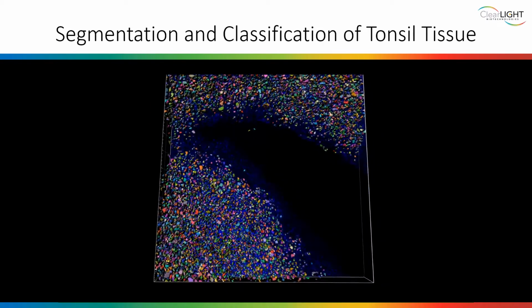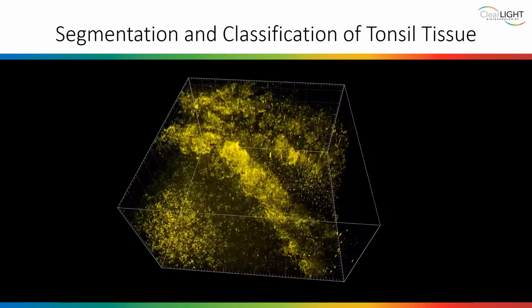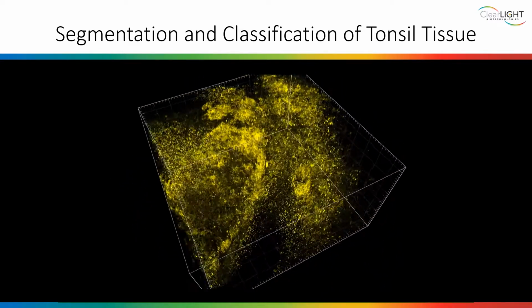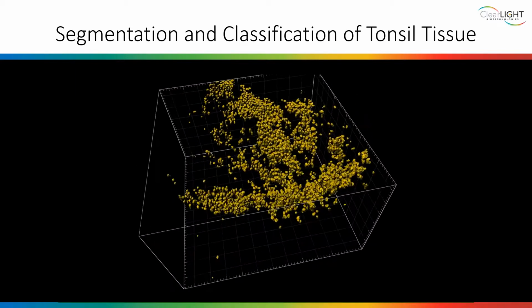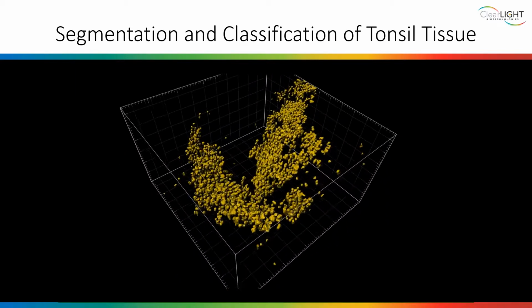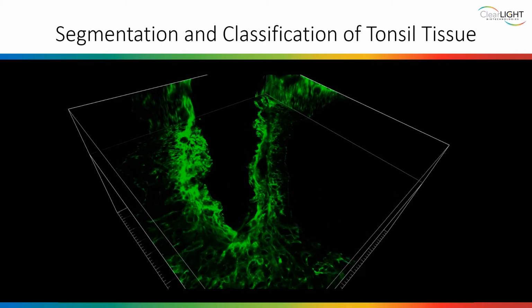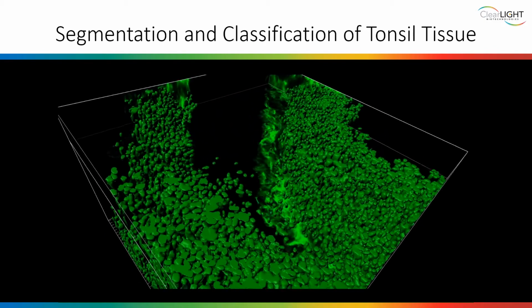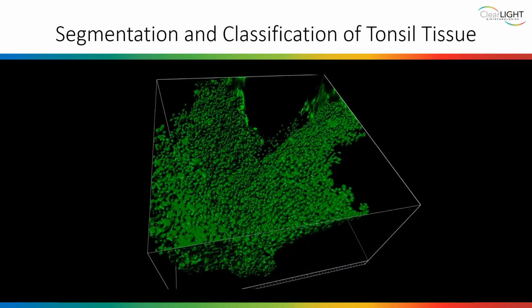First, DAPI stains the cells in our tissues. Then our AI method can automatically process this information and represents each cell nuclei with a different color. You can see how PDL1 is used to automatically discriminate which of these cells are PDL1 positive and display them separately. You can then see pan-CK, which stains epithelial cells, and then finally, you see the CD8 marker.